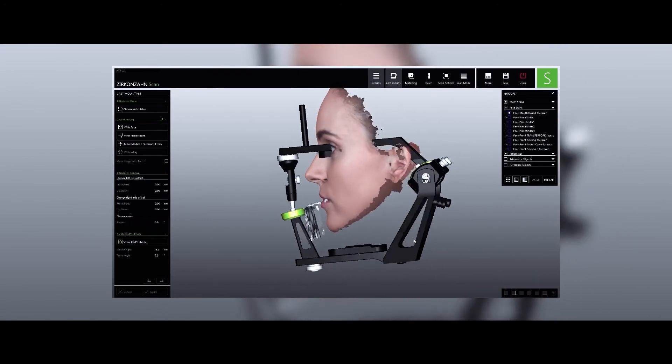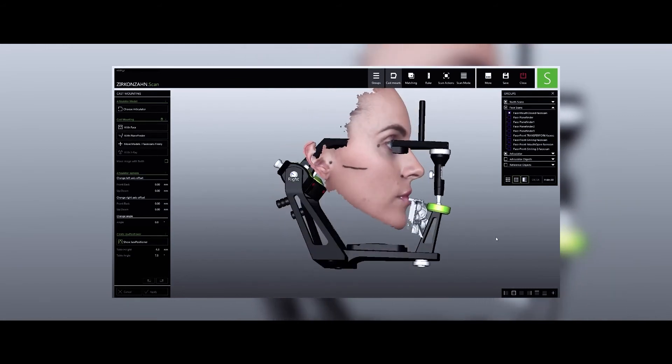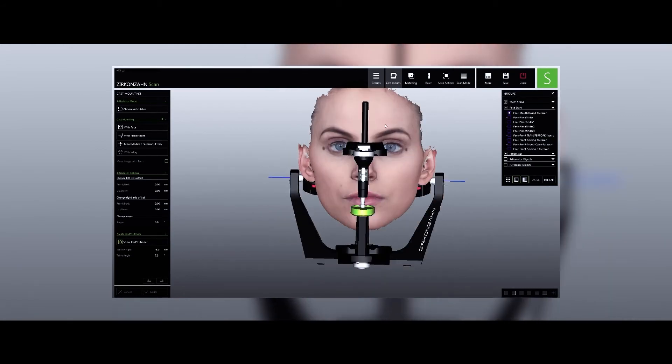Once all available data is combined, we are able to correctly position the patient in the PS1 Virtual Articulator.